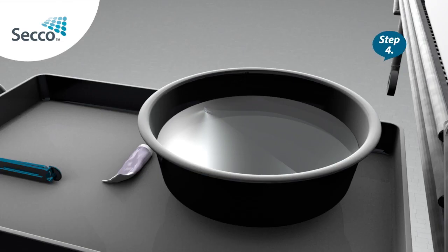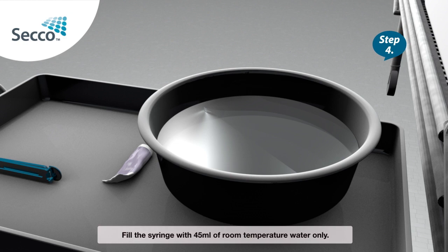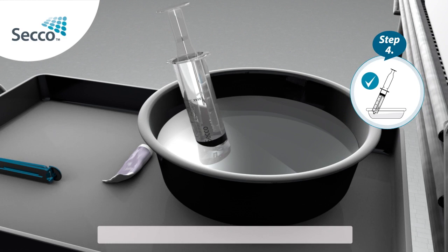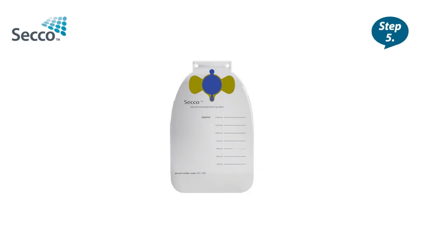Step 4: Fill the syringe with 45ml of room temperature water only. Do not use hot water.